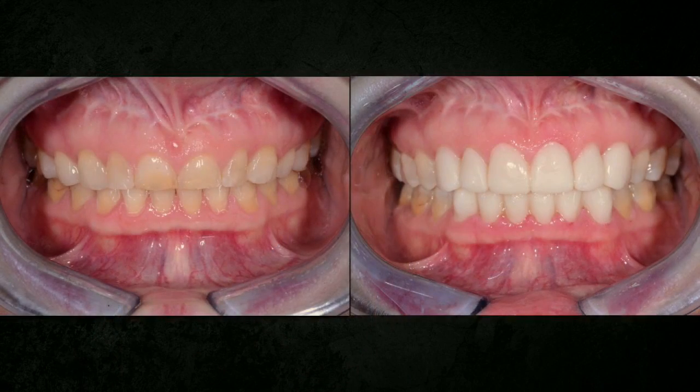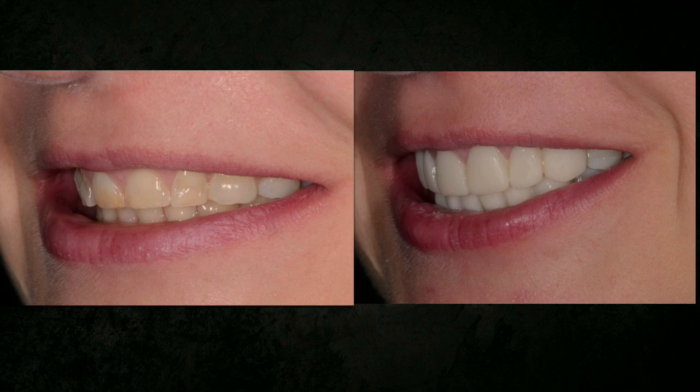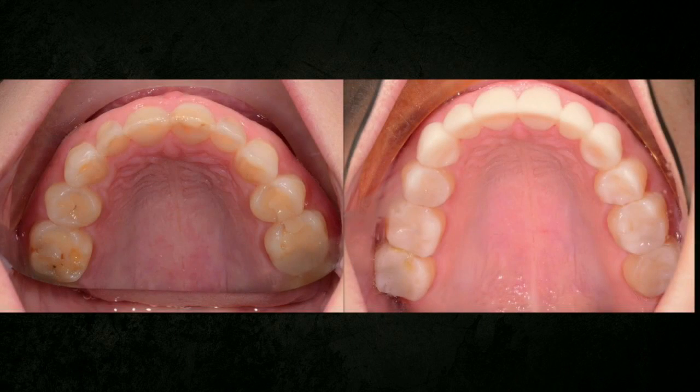And then, as we look at this, we're happy with the length, the smile, the more relaxed looking face. And now we can copy these contours that are working. There are the provisionals in the anterior and the resin onlays in the back.